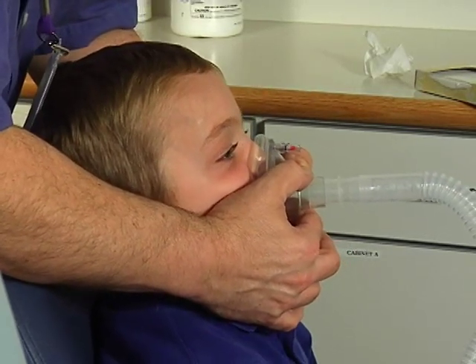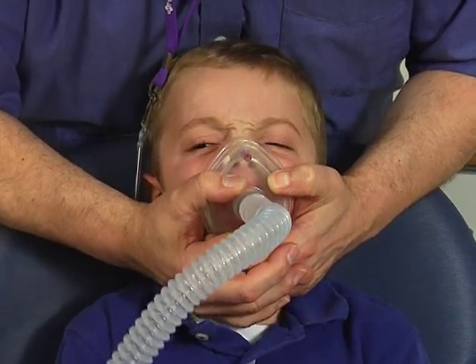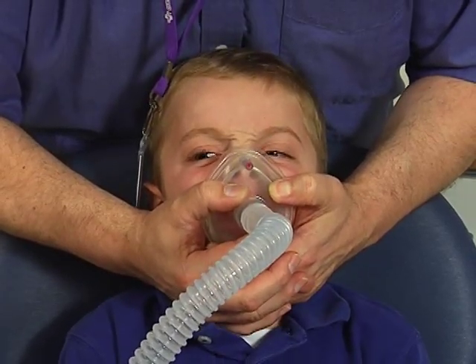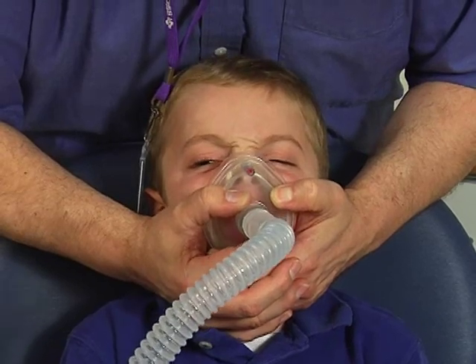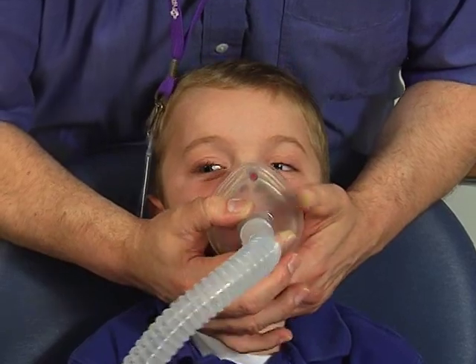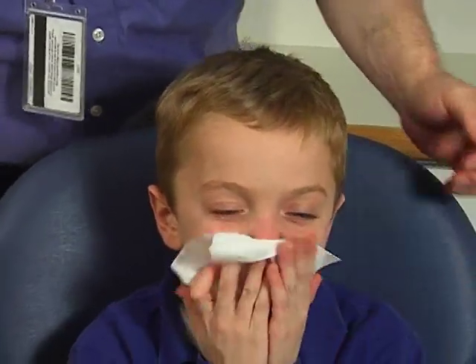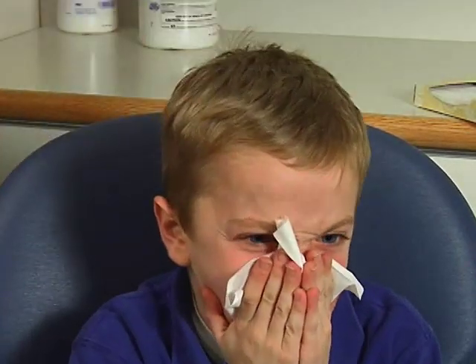As you breathe in, the machine will help by giving a big breath of air. This breath will end at the time set on your machine. As you breathe out, the machine will help by sucking the air out. During this time, you should perform a cough or huff during the exhalation phase. This will help your cough be much stronger and it will help to remove any secretions.